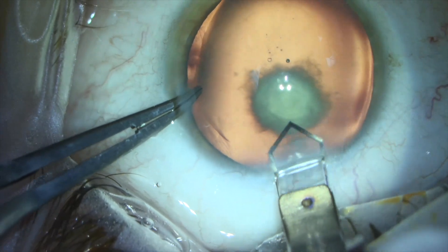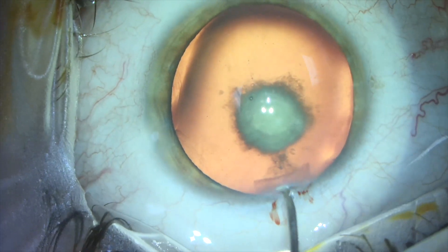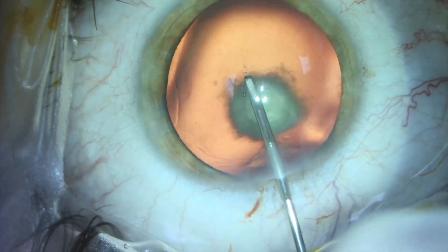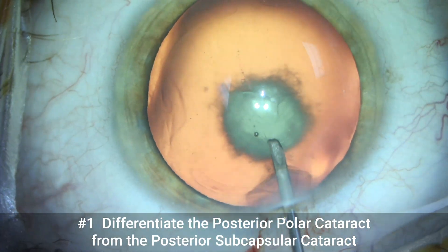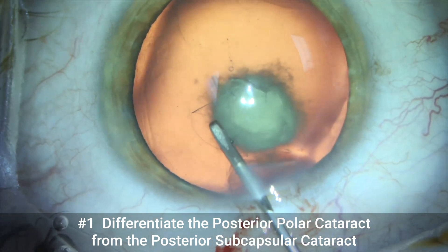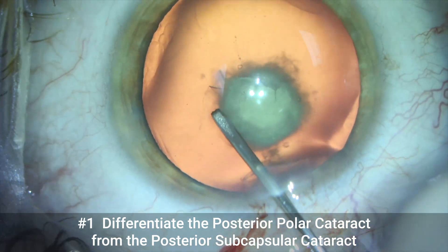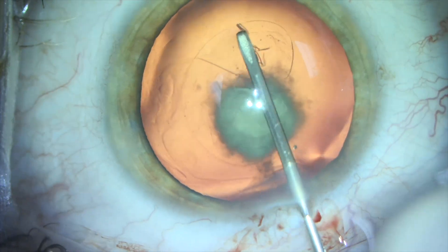We begin the surgery in the normal manner and create a five millimeter capsulorhexis using a bent needle cystitome. The first thing we need to do is differentiate the posterior polar cataract from a posterior subcapsular cataract. The posterior polar cataract has more depth and thickness than a posterior subcapsular cataract, which tends to be flat and thin.